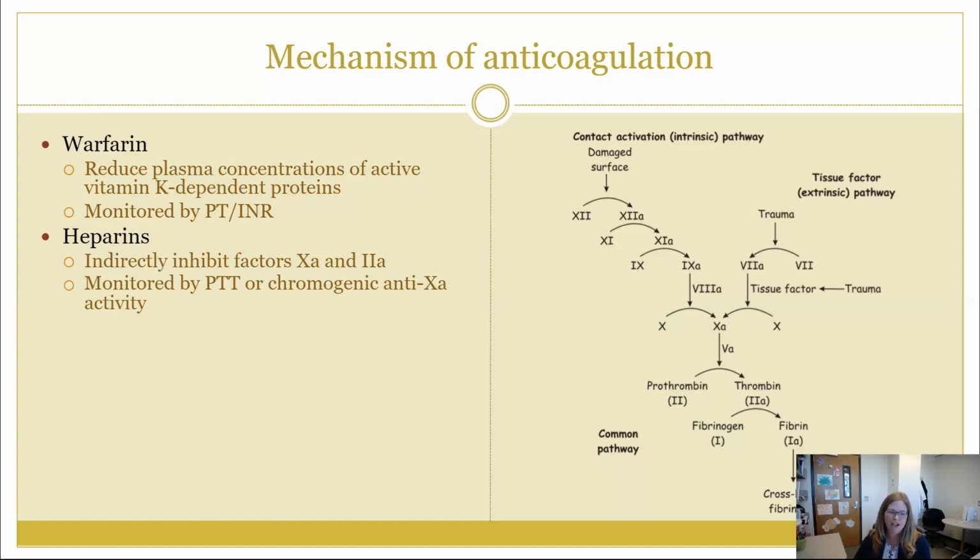Now, unfractionated heparins are indirect inhibitors. They accelerate the action of antithrombin against activated factor 10 and against thrombin. Unfractionated heparin therapy can be monitored in a couple of different ways. You can use the partial thromboplastin time, or you can use a chromogenic anti-10A assay.